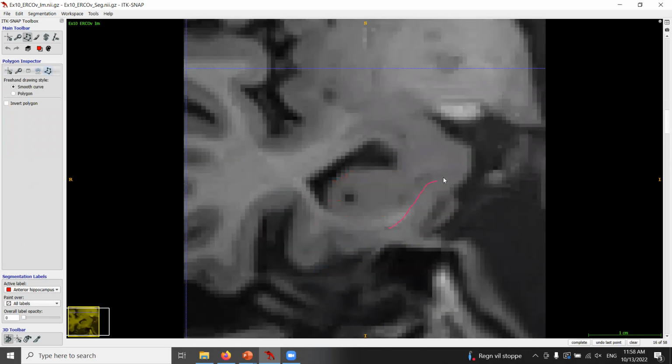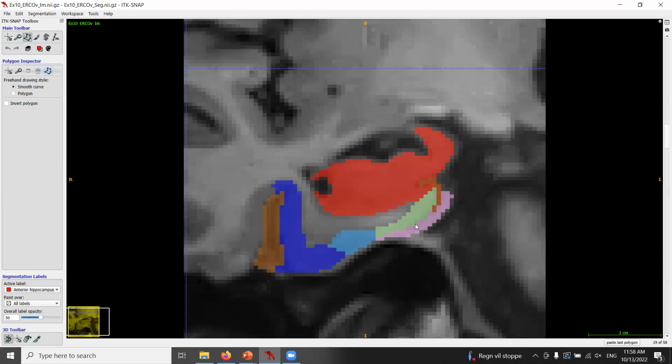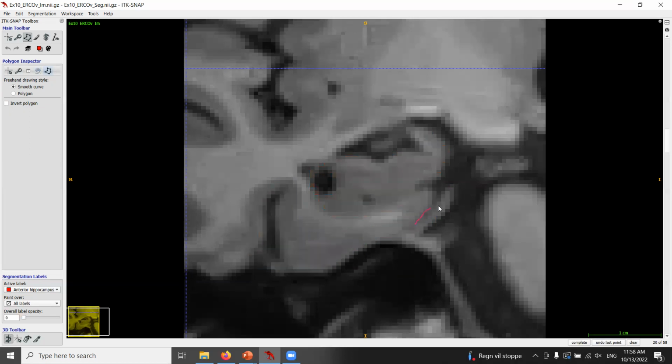Here, I would say, well, actually, I'm over segmenting a little bit, yeah. It might be a little bit under segmented on that end, but it's hard to see. Yeah. I would say maybe a little bit more could have been done, but these are still quite small errors.